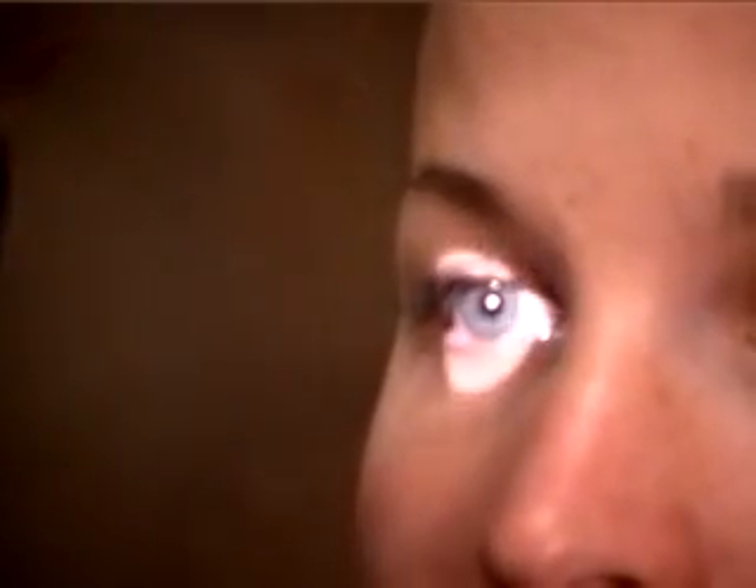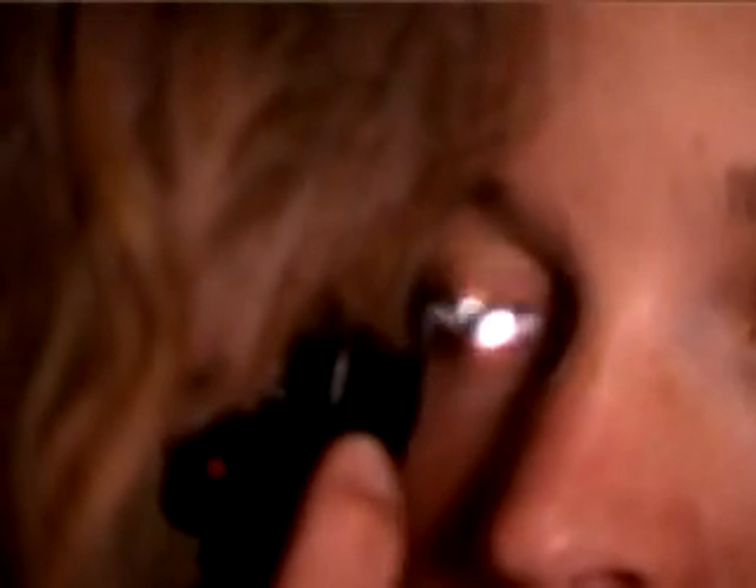When you're doing the ophthalmoscope examination, you want to shine the light in the eye, get the red reflex, and then move in on the red reflex. In order to see the disc, you have to be very close. I use my third finger on the patient's cheek, and sometimes I even rest my thumb on the brow. That is how close you have to be to see the optic disc.